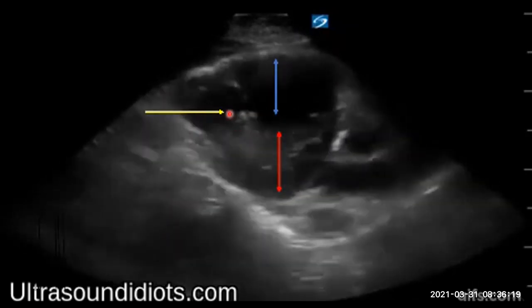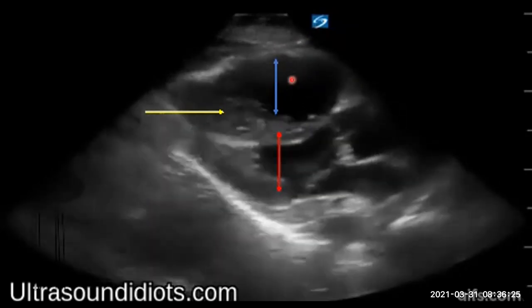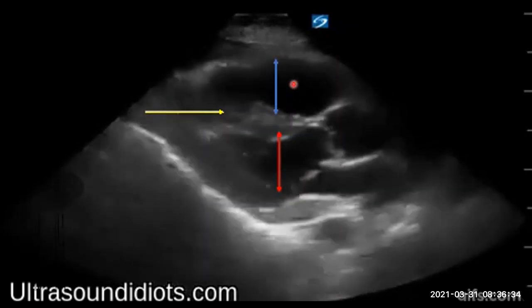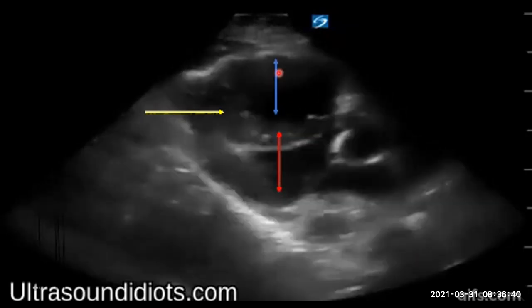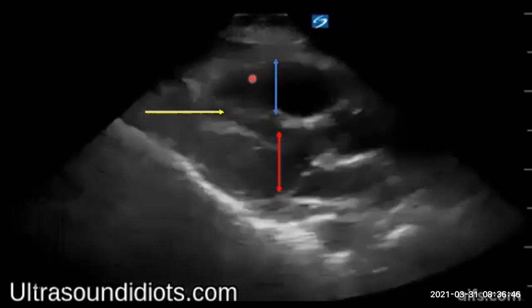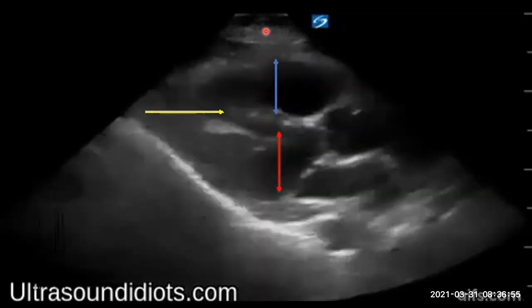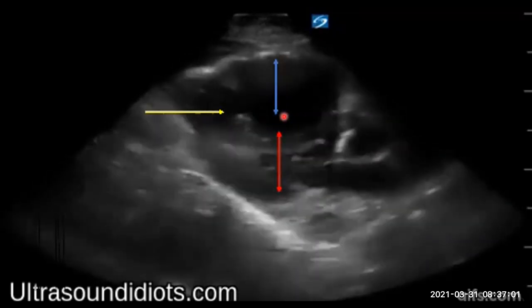Right. So what do we say we expect to see in the right ventricle? So that's our right ventricle. What are we expecting? Very good. So what should be larger, the left ventricle or the right ventricle? In a normal heart. All right, but in this case, which one is larger? Right ventricle by quite some way, isn't it? If you divide this whole region into thirds, 2/3 should be taken up by the left ventricle, 1/3 should be taken up by the right ventricle. Now we've got almost the opposite, that's true. We've got this very dilated right ventricle because of that amount of backup that's happening.